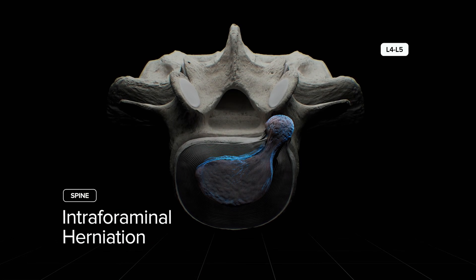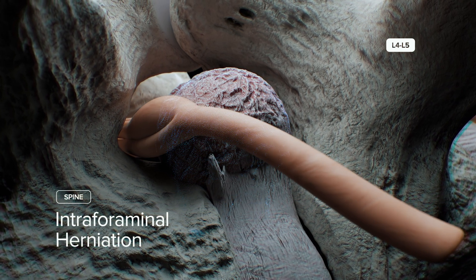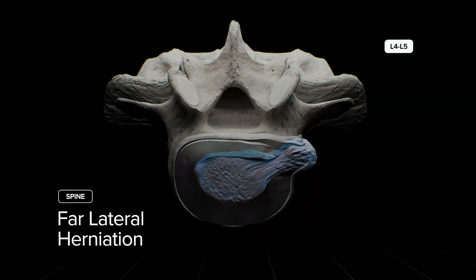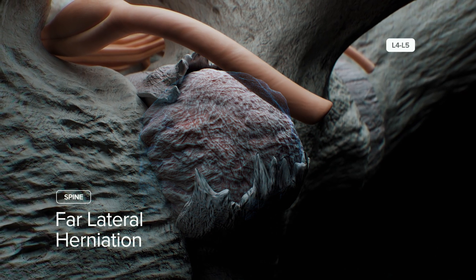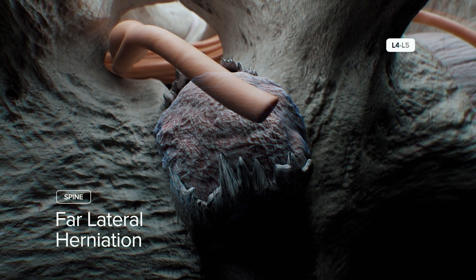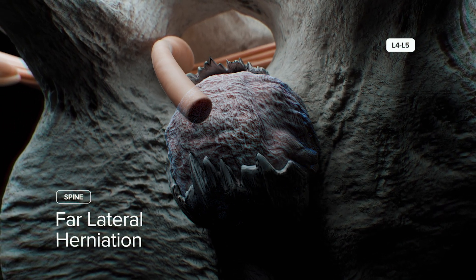Here is an intraforaminal herniation within the foramen. With proper targeting, the scope will land directly upon the herniation, making this another good beginner case. If the herniation is cranially extruded and dorsally displacing the DRG on the exiting root, you must visualize the bony floor of the foramen, which is the back of the cranial vertebral body underneath the DRG and exiting root. Far lateral herniations are more technically challenging because you need to turn the scope around 180 degrees and there is no bony architecture to hold the cannula and endoscope in place. This means you need to control both the depth and rotation of the cannula, endoscope, and instrument all at the same time. The DRG often needs to be retracted to expose the herniation, which induces a 20% risk of radiculitis from root retraction and reperfusion of the DRG.